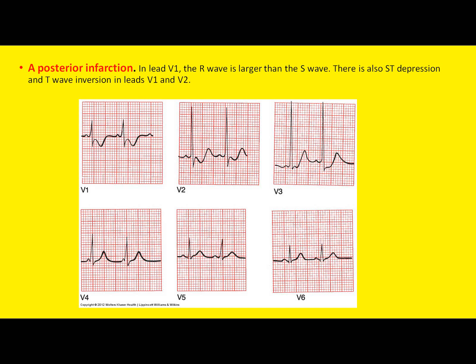But when we see this, I tell the nurses, call back the ECG technician. I want him or her to do another ECG with V7 and V8 in the back.